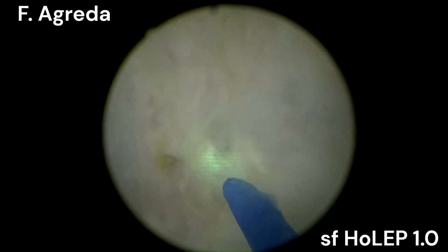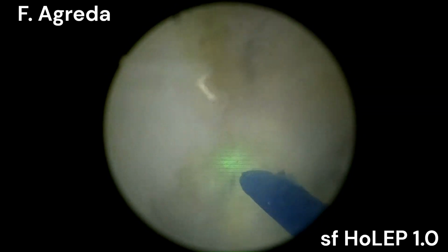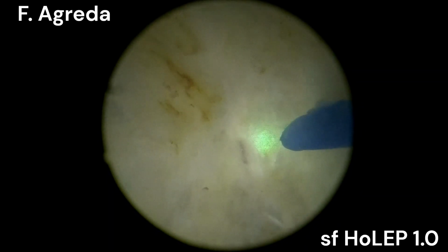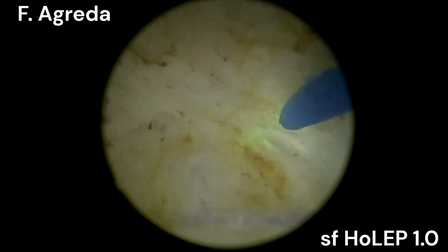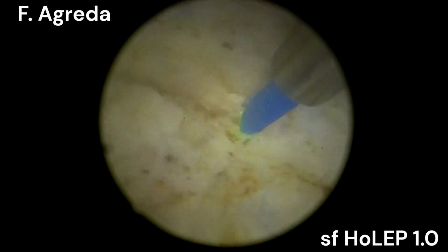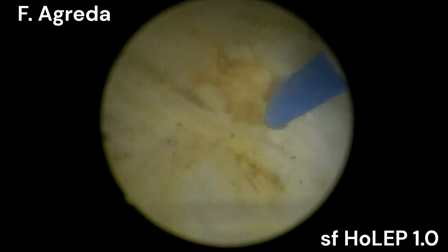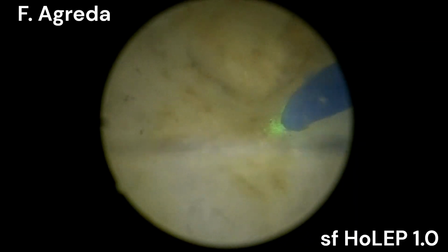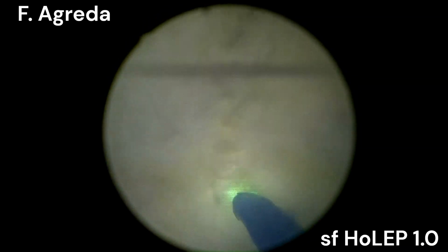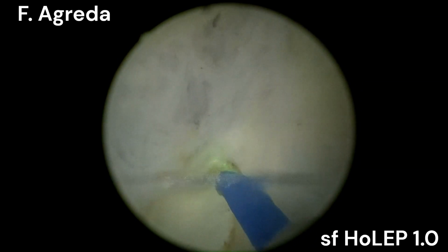So the most difficult part of this SF HoLEP, I would say, is the first dissection of the anterior part of the sphincteric mucosa and locating the anterior prostatic capsule, because there are no references in there. There is no capsule you can see, there's no urethra you can see, there's no bladder you can see, so you have to be very careful and trust the process.